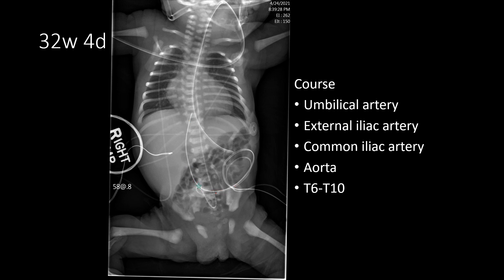So again we see the umbilicus here with both catheters converging. The umbilical arterial catheter courses down into the pelvis and then along the left side of the spine, while the umbilical venous catheter courses along the right side of the spine and has a smoother entry.